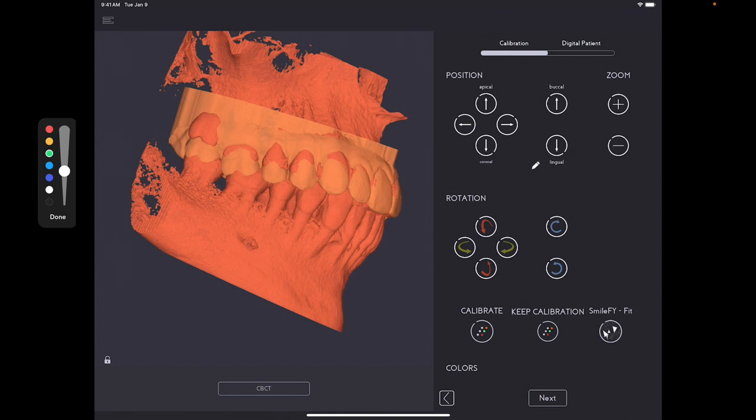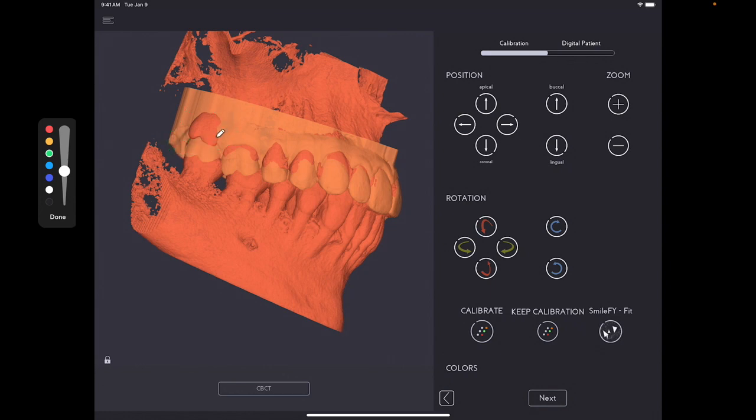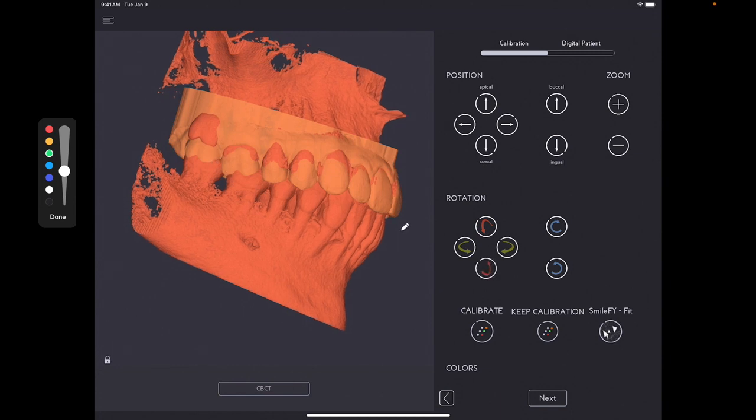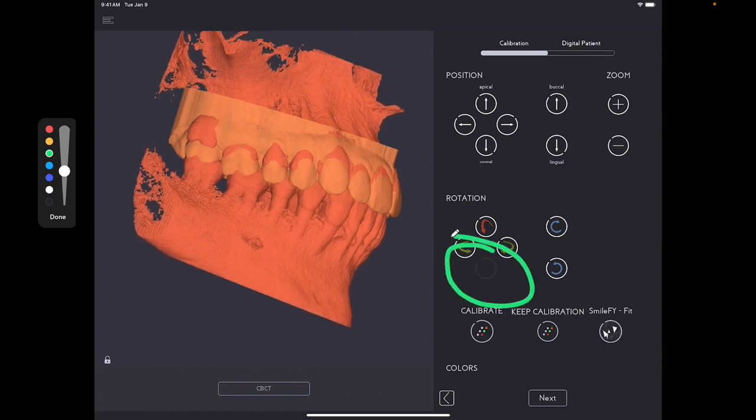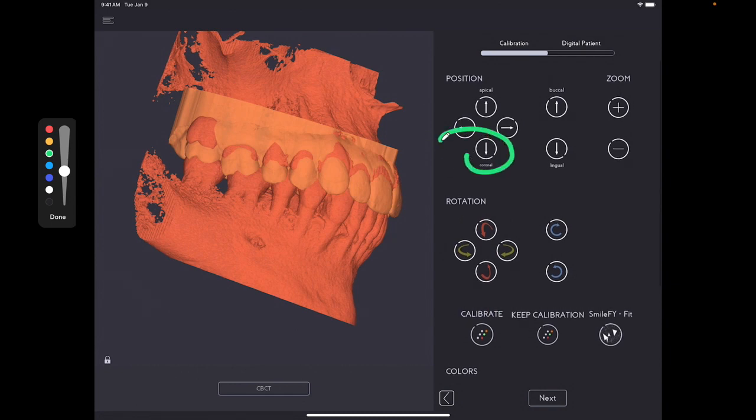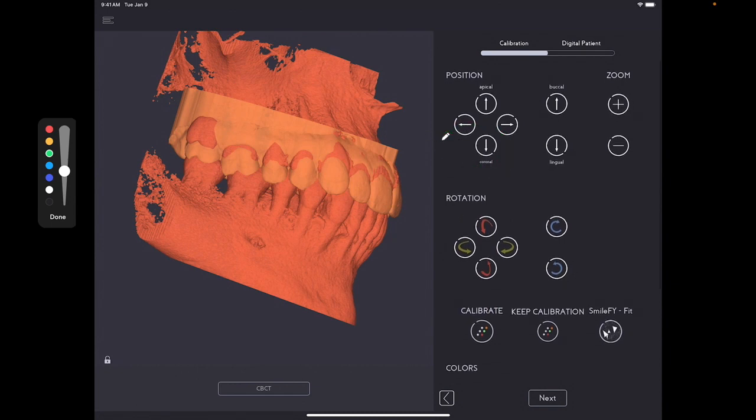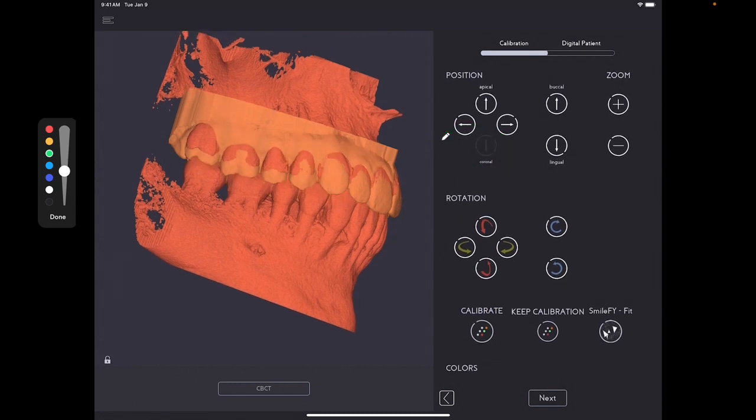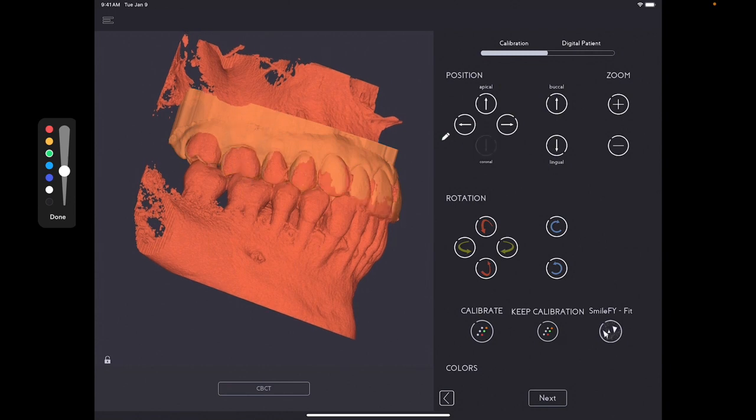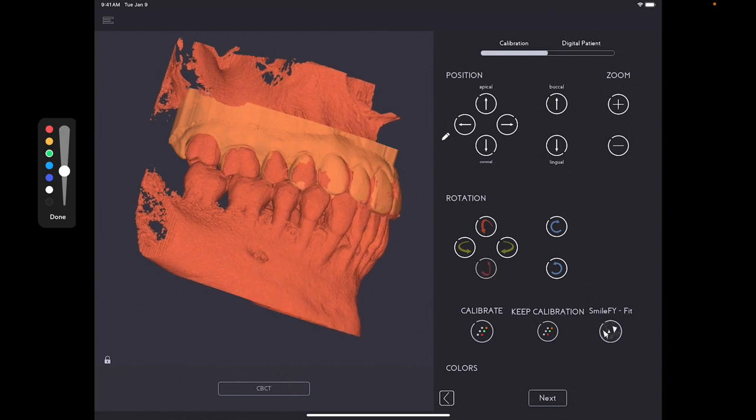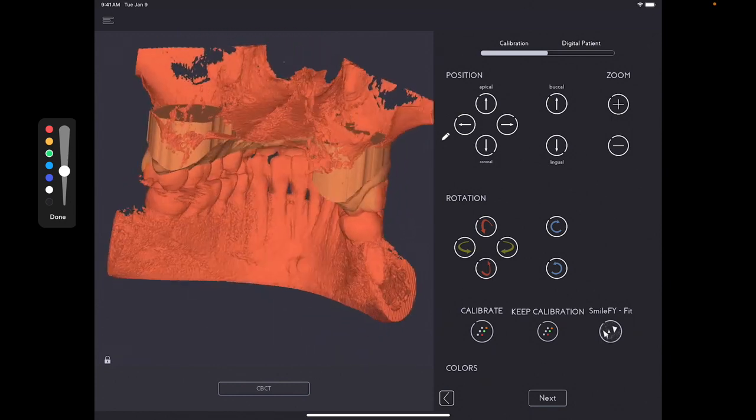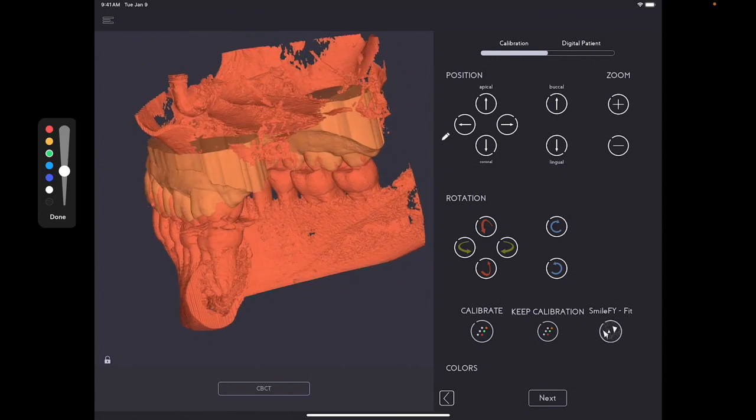So here, for example, see that these molar from the CT scan is much higher than the one on the STL. That means I need to use my rotation and then bring that down a little bit. And I'll still bring it more coronal. There we go. And now, as you can see, it's calibrated.